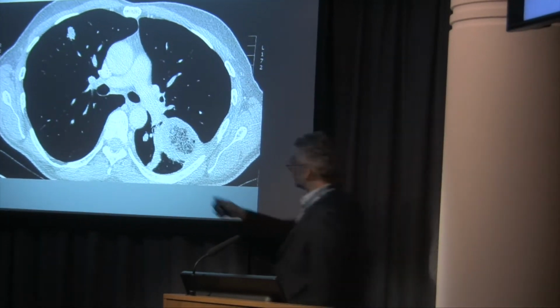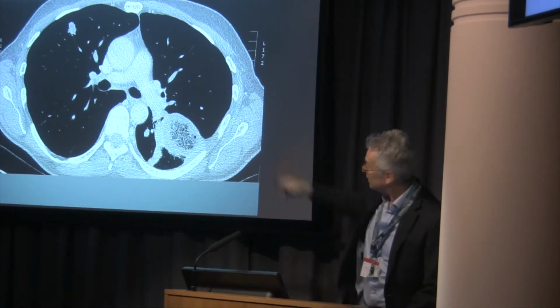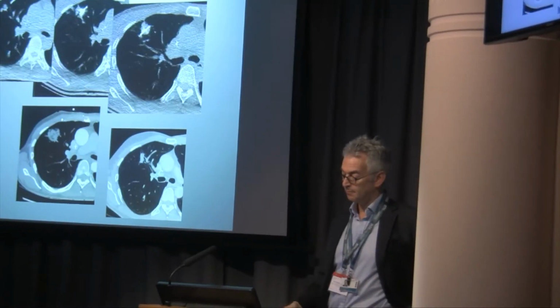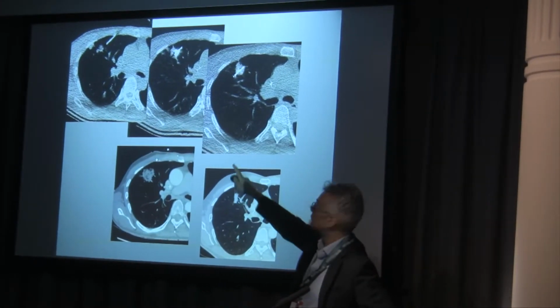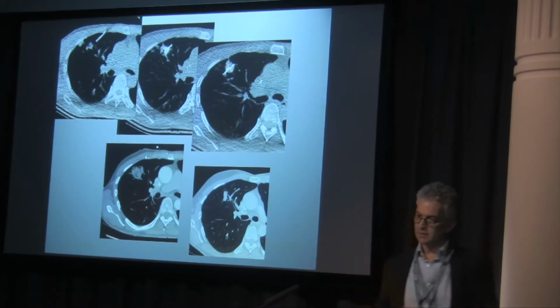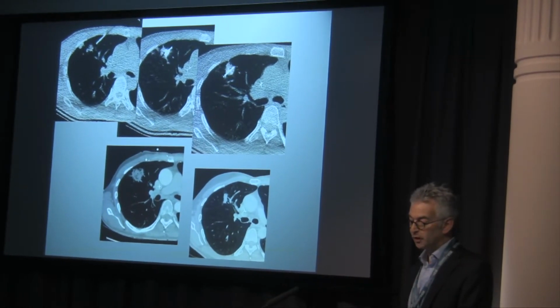You can see here there's a couple of colorectal metastases that have been already resected. That's made a bit of a mess, but there's still these things. So it was sent for microwave, just another form of heating and ablation, but you've got to get the needle in. So here's a whole series. You follow it down, you can see the white stick is the needle, approaching the metastasis, skewering it, treating it, and a few months later you're left with a resolving scar. It's all beautifully shown because of the natural tissue contrast between the air and the tumour in the lung.